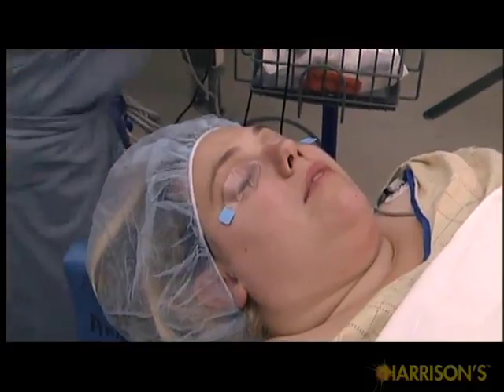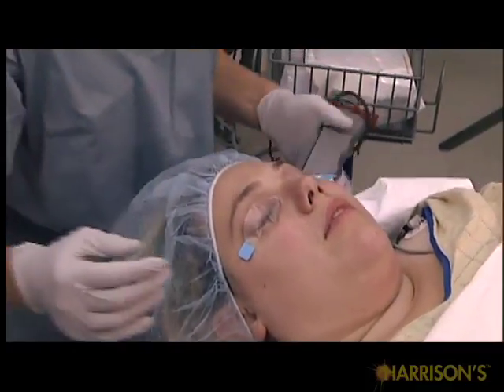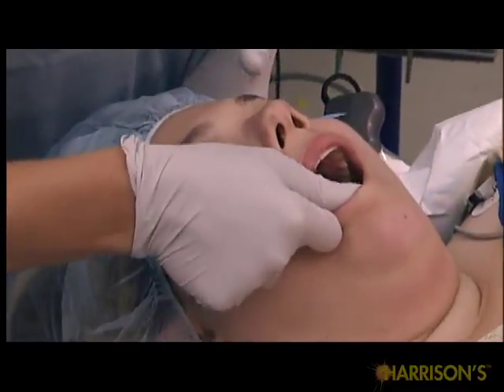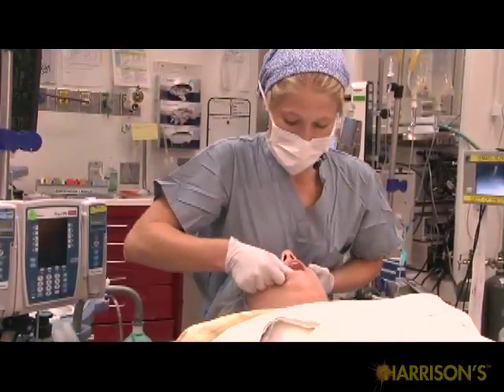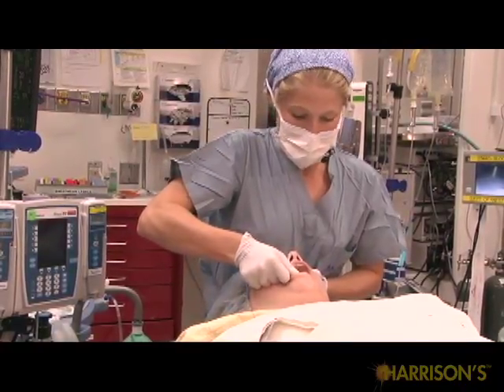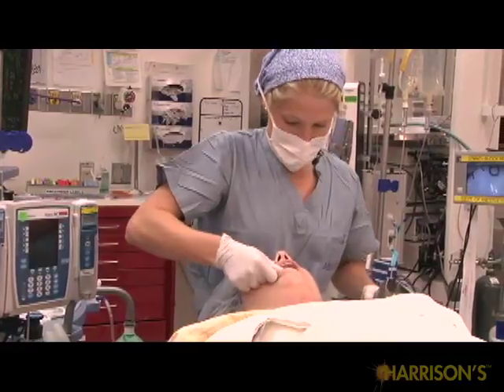Use your right hand to scissor the mouth open. Place your right thumb in the bottom right corner of the patient's mouth on the back lower molars. Place your right index finger in the upper right corner of the mouth on the back upper molars. These fingers should be extended to maximally open the mouth.